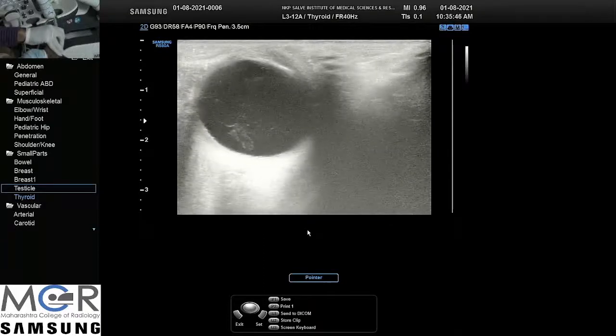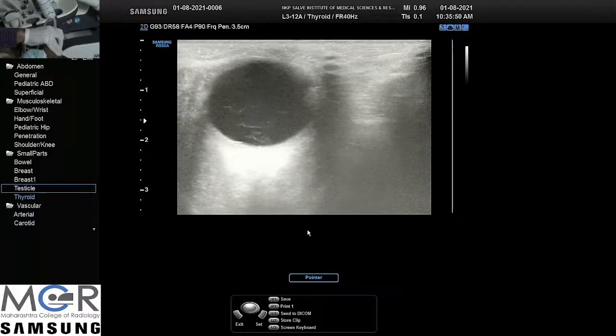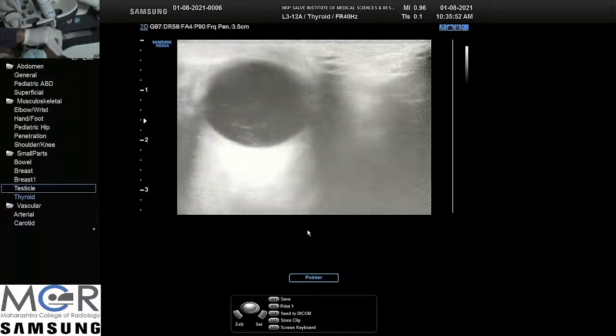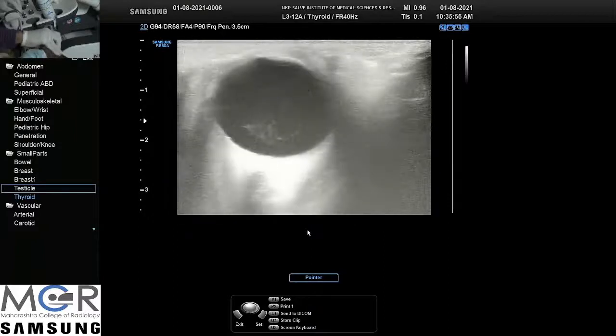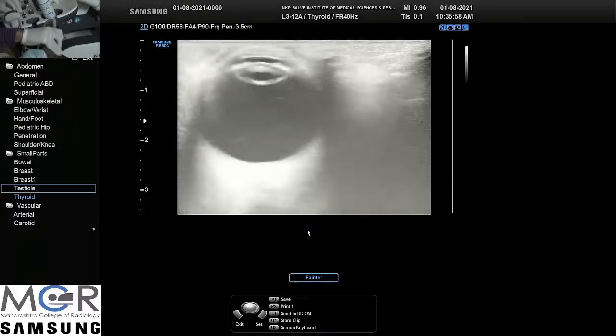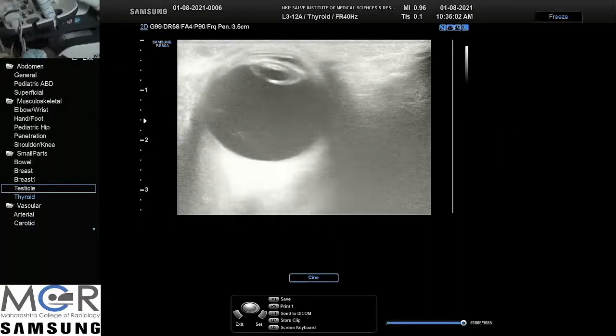You can see that they are freely mobile. So this could be a small PVD, but definitely not worrisome. They can definitely go ahead with the cataract surgery. So such information we can give them before going for cataract surgery.